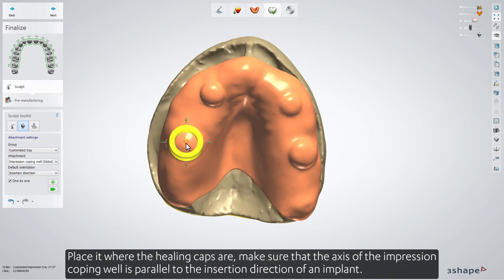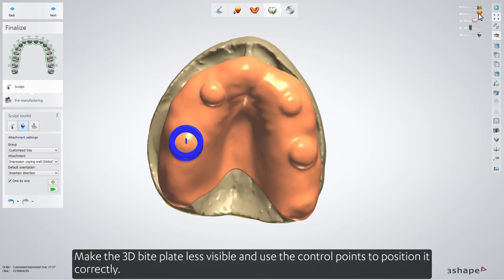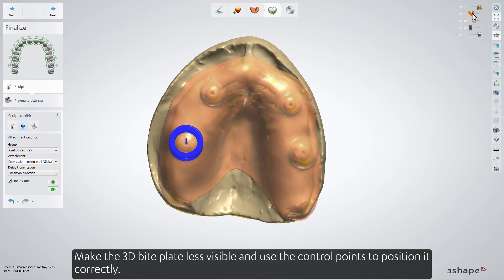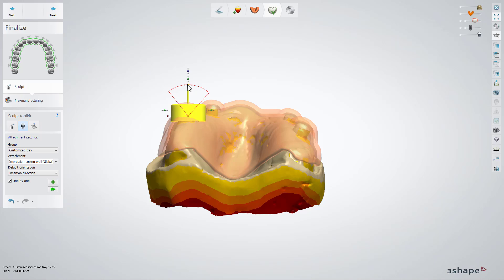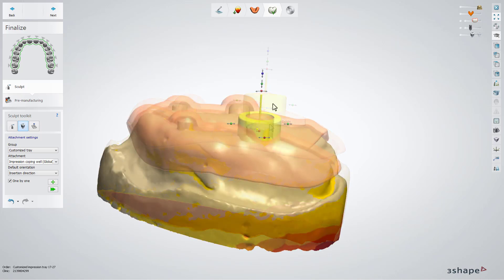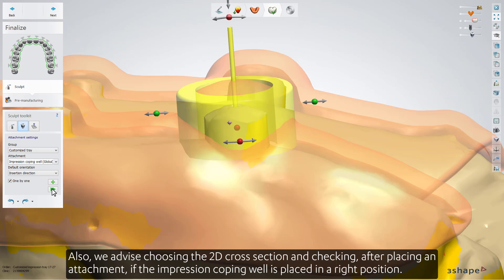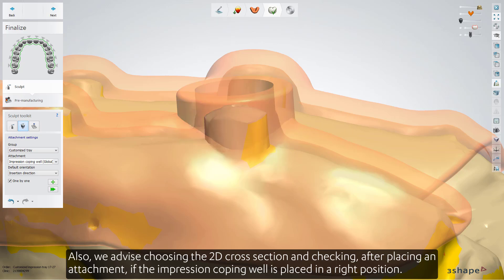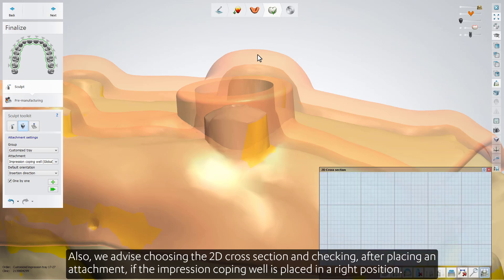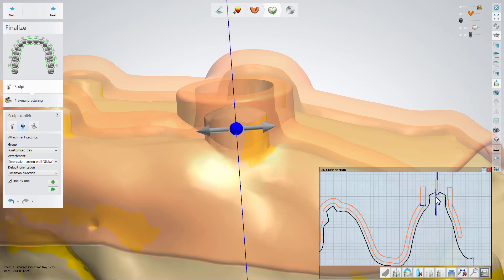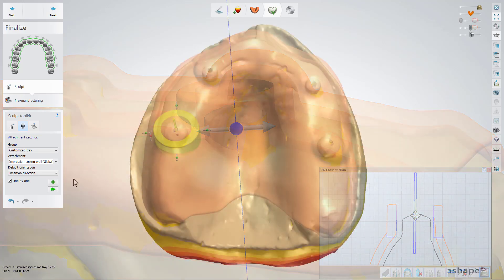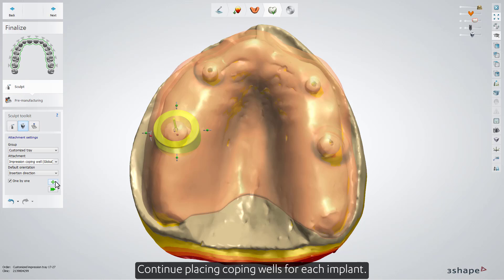Make sure that the axis of the impression coping well is parallel to the insertion direction of an implant. Make the 3D bite plate less visible and use the control points to position it correctly. We also advise choosing the 2D cross section and checking, after placing an attachment, if the Impression Coping Well is placed in the right position. Continue placing Coping Wells for each implant.